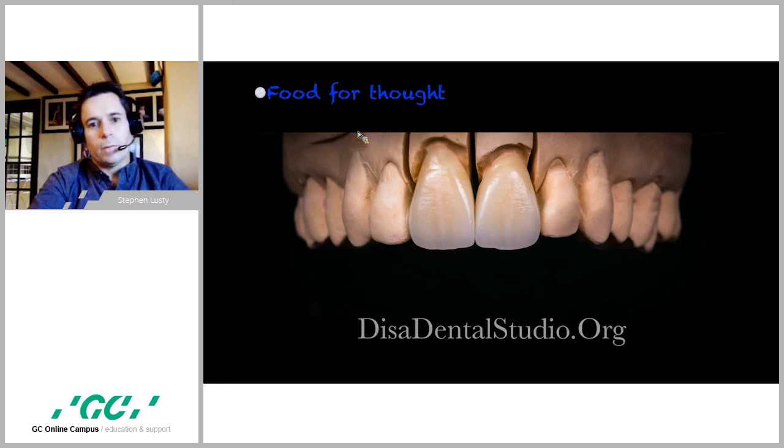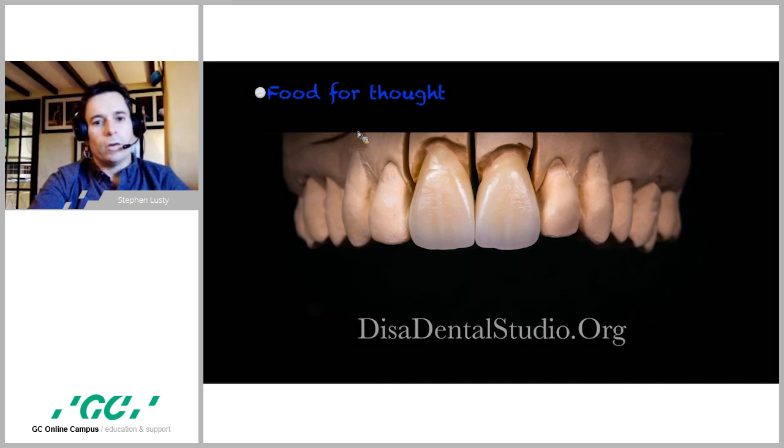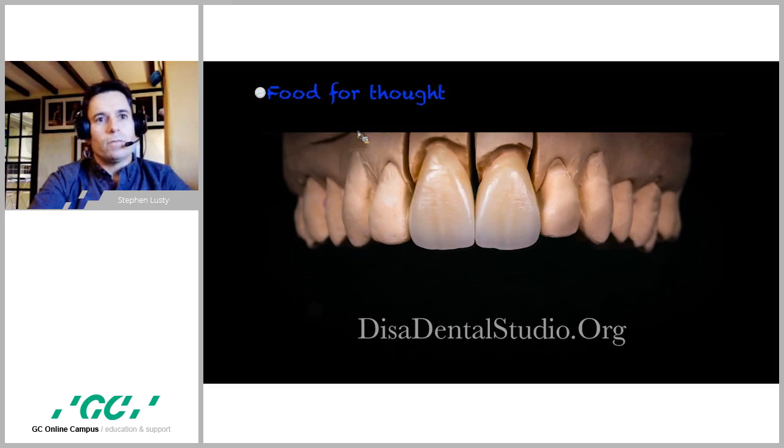The 1,200 megapascals covers the entire preparation, and then you have 500 megapascals wrapping that whole lot up. So that, to me, makes far more sense than any sort of multi-layered zirconia ever would, because multi-layered zirconia really is only the strength of the weakest part of it because of this horizontal banding. And that generally is around about 600 megapascals anyway. So I think that this probably has got legs, and I think you need to watch this space, because I do think that this is something that's going to be used more and more over the next few years.